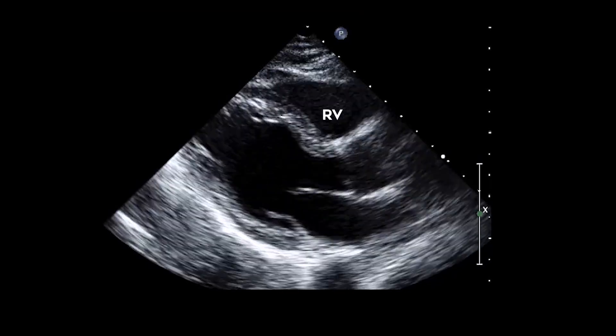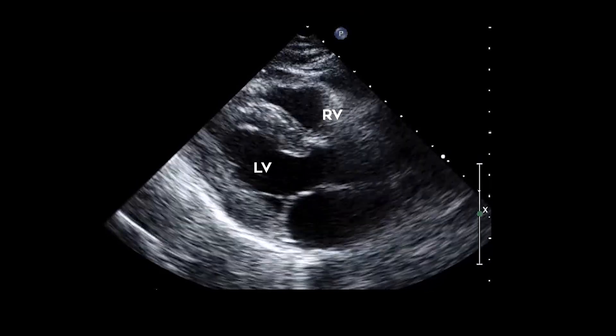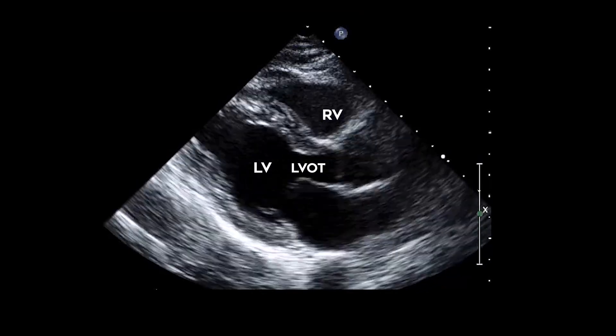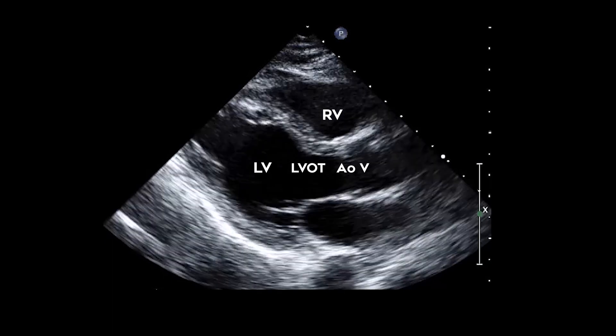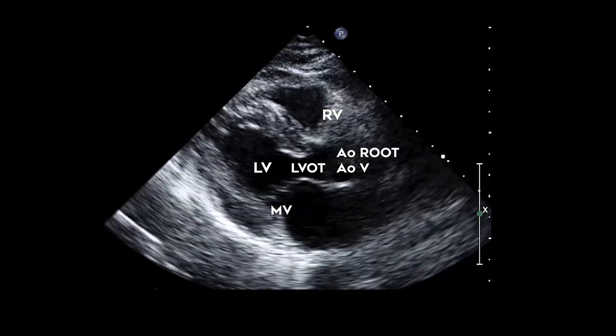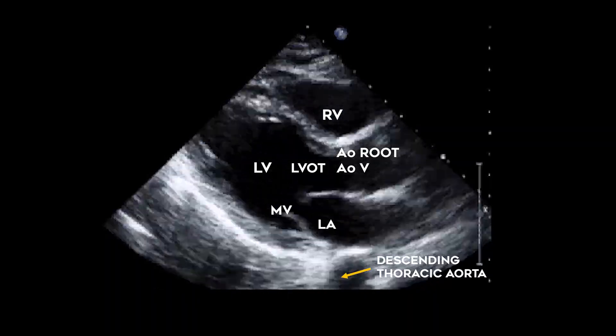Let's start by reviewing the structures we see in the parasternal long axis view. They are the right ventricle, the left ventricle, the left ventricular outflow tract and aortic valve, aortic root, the mitral valve and left atrium, and the descending aorta.